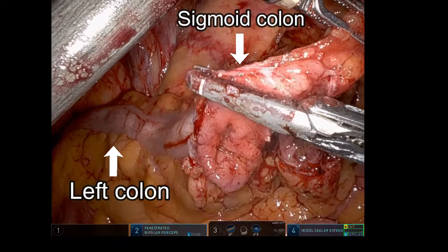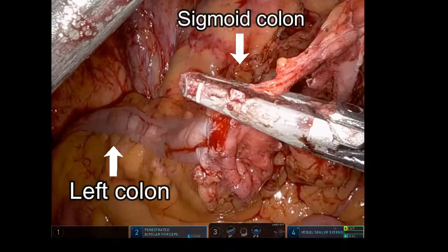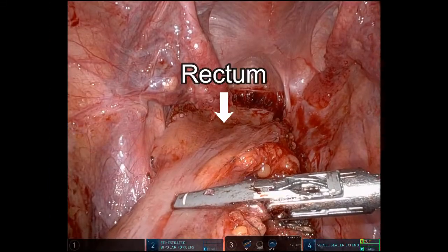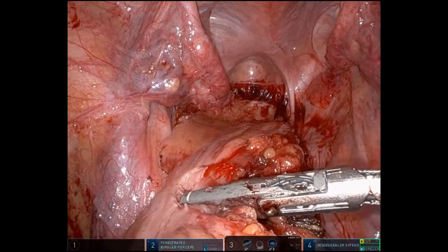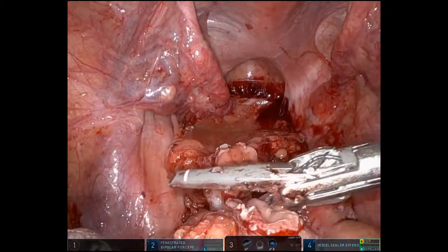In this nicely done vignette, we're going to be showing what to do with the difficult anastomosis. This is a patient with diverticulitis. We did our proximal resection, and here we're doing our distal resection right at the upper third of the rectum using Vessel Seal Extend.